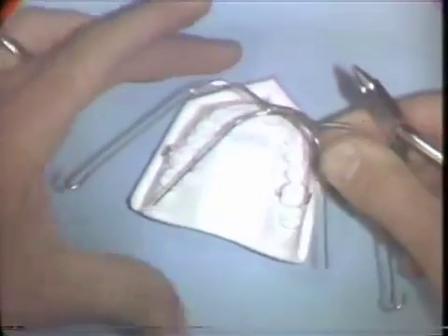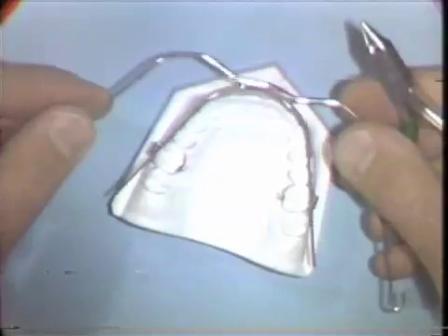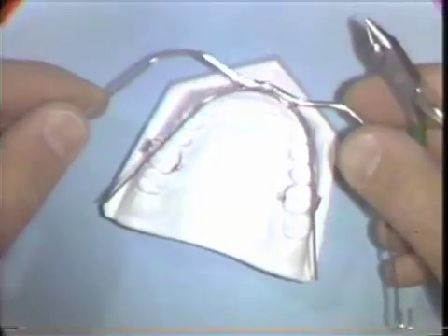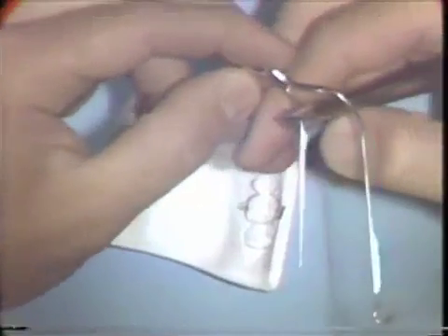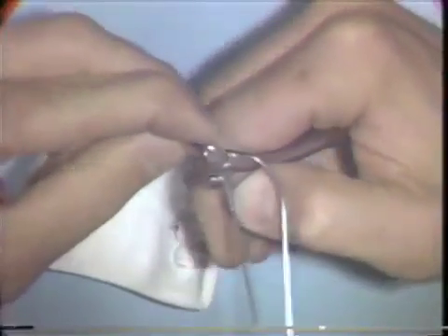The first step is to expand the anterior portion of the inner bow so that it adapts roughly to the labial surface of the anterior teeth. The flat base portion of the 139 pliers is used for this procedure.